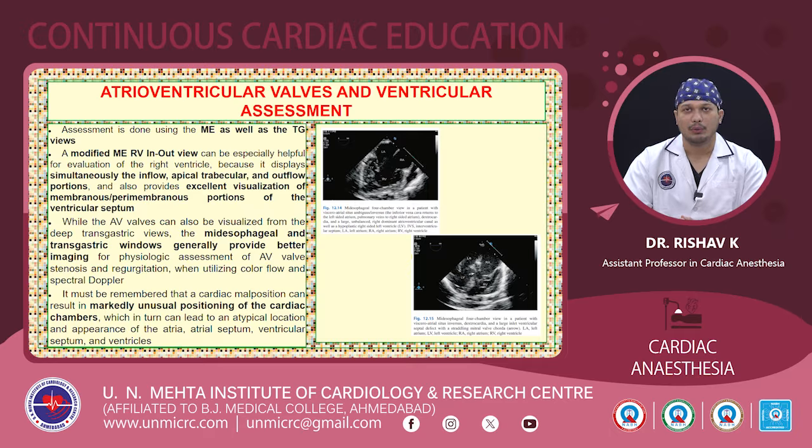However, we must always keep in mind that cardiac malposition can result in markedly unusual positioning of the cardiac chambers, which in turn can lead to an atypical location and appearance of the atria, atrial septum, the ventricular septum and the ventricles. So, as I have repeatedly told, we must not assume anything regarding the anatomy of the patient, and the TE assessment should be structure based and not view based.